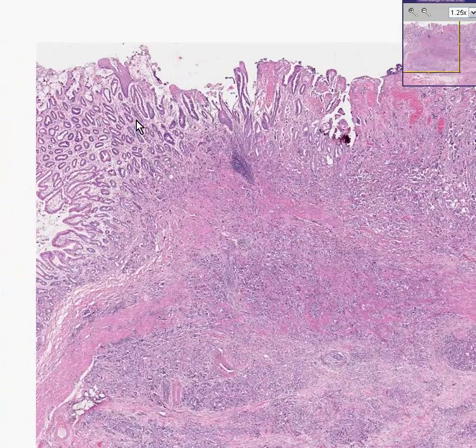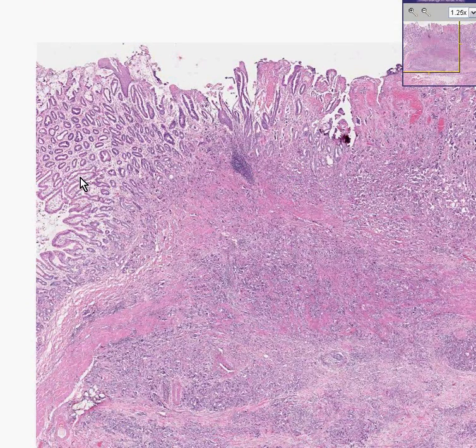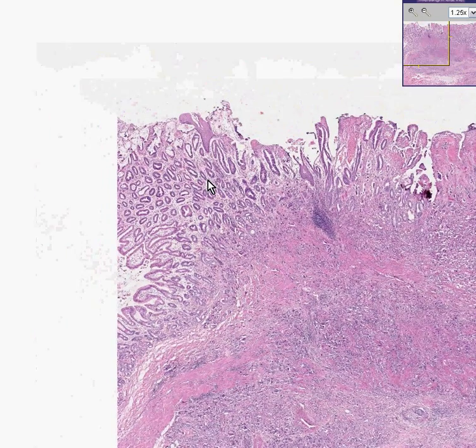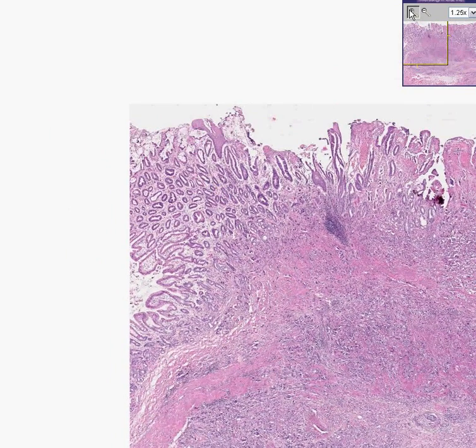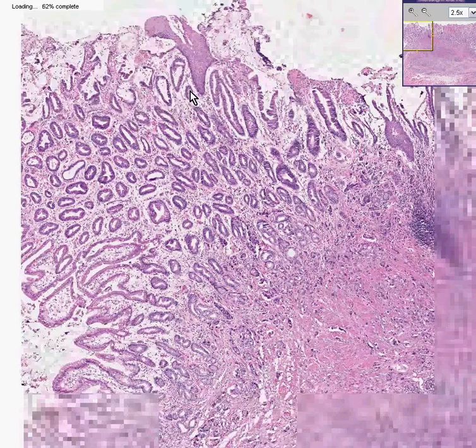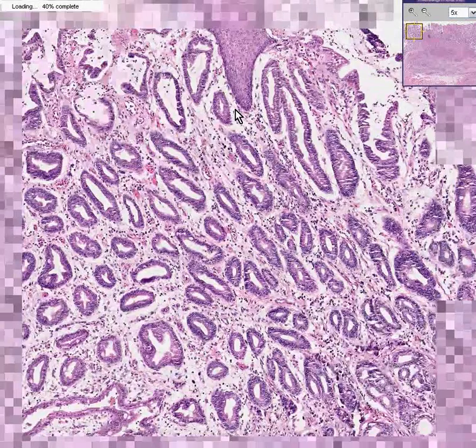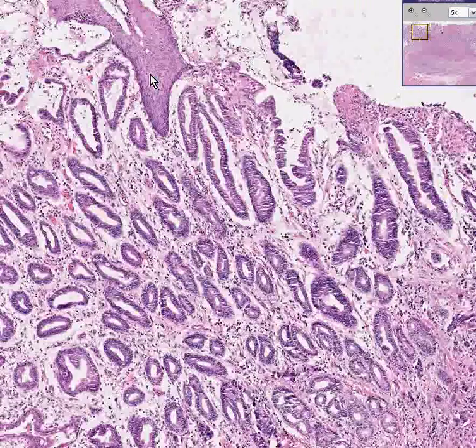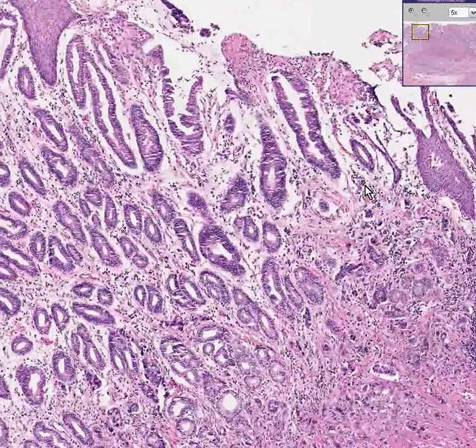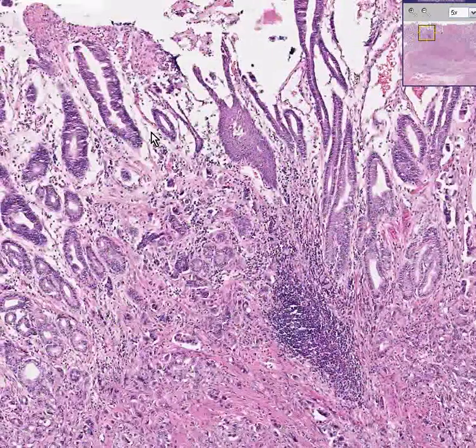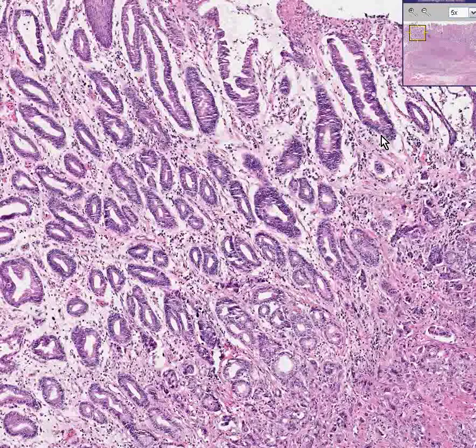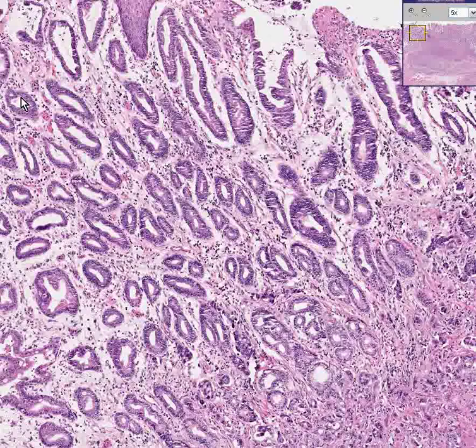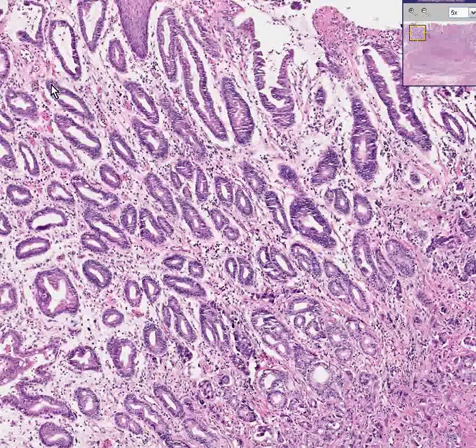You're going to have to take it on faith that this is an esophagus, because you don't usually think of the esophagus as having a glandular mucosa. However, you can see a little remnant of squamous over here, and another over here. But in this area, the mucosa is benign but glandular, looking very much like gastric mucosa.